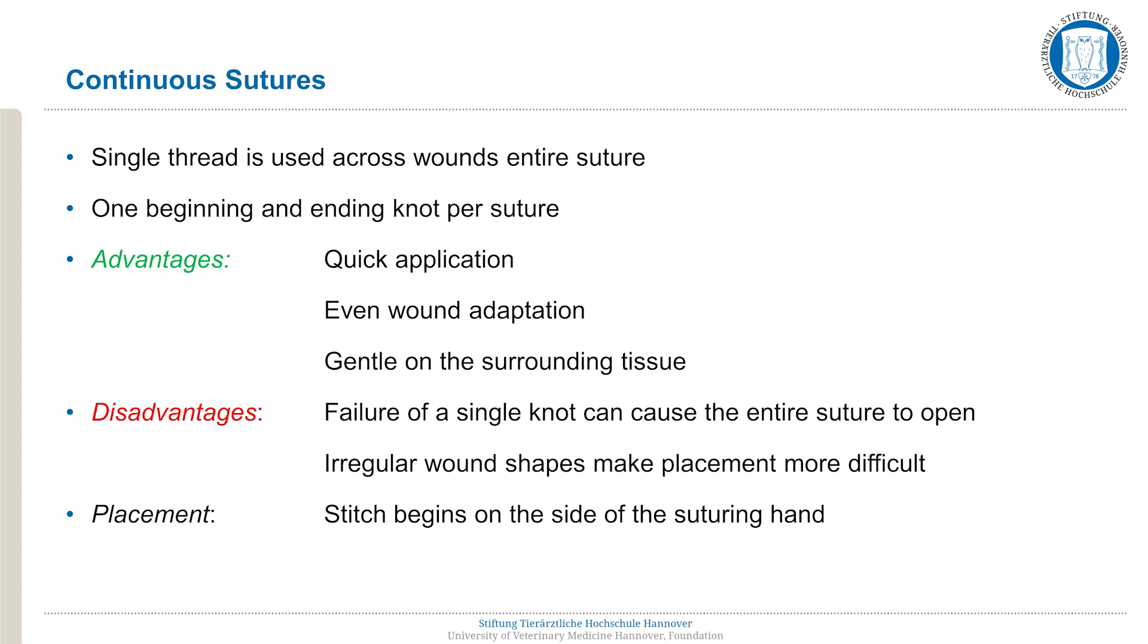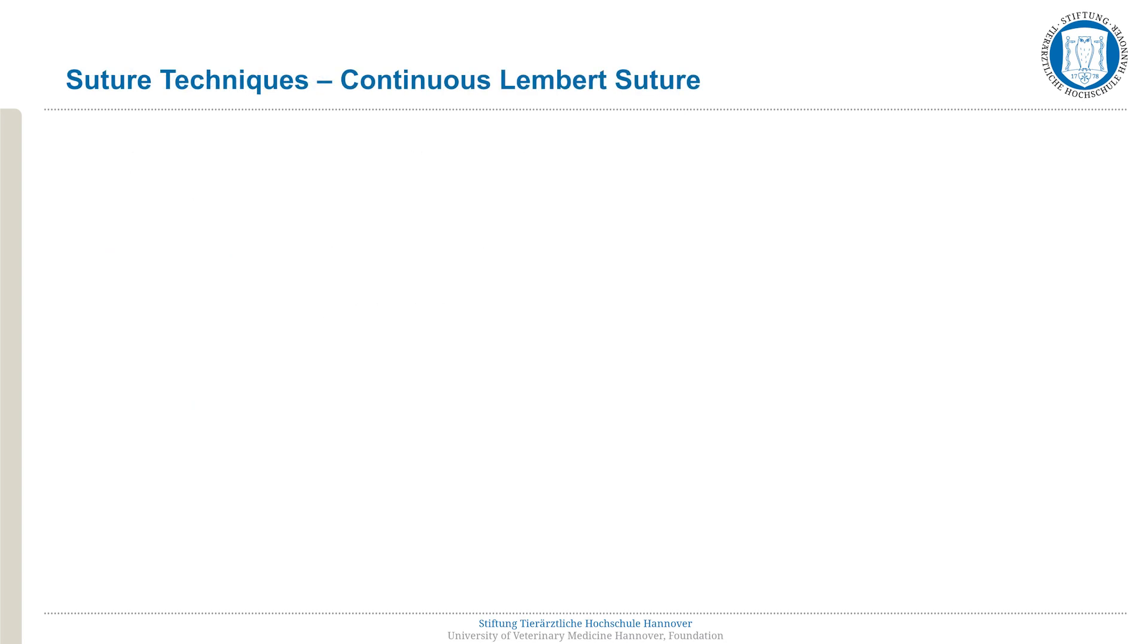When placing continuous sutures, the stitch should begin on the side of the suturing hand. The Lembert suture is suitable, in conjunction with another suture, for the closure of hollow viscera, such as the uterus, bladder, intestine, or crop.